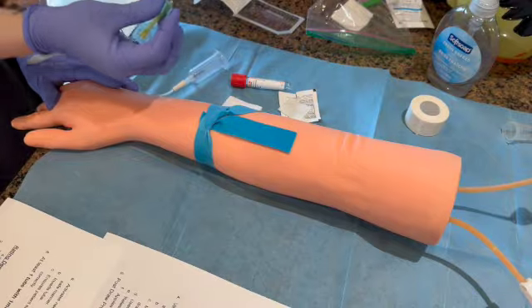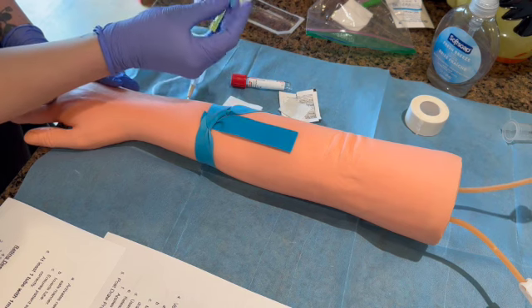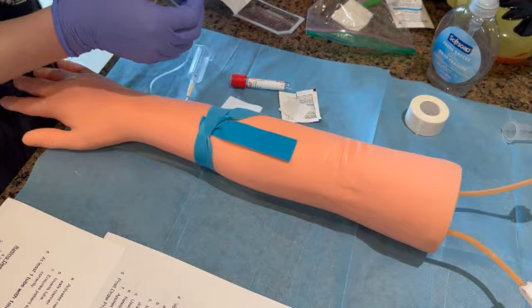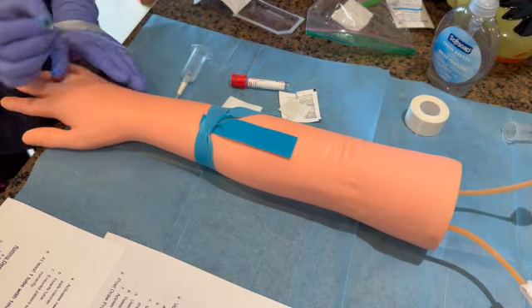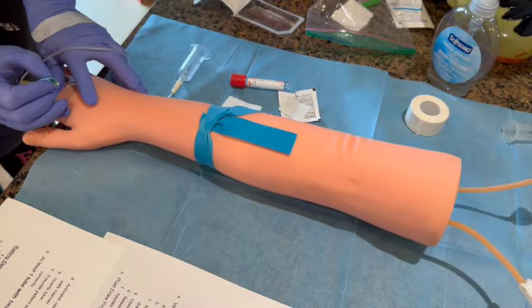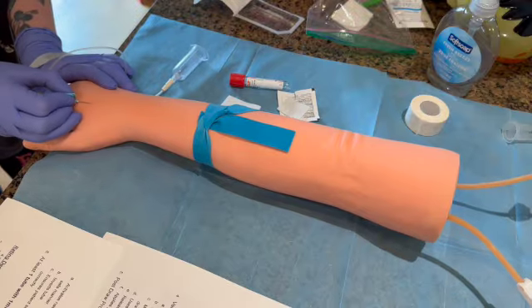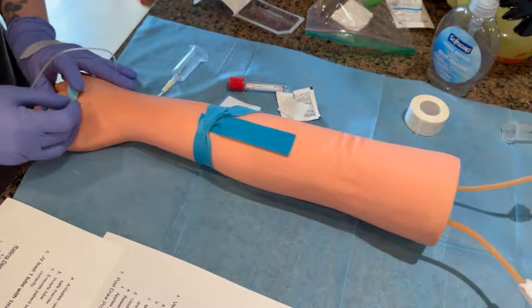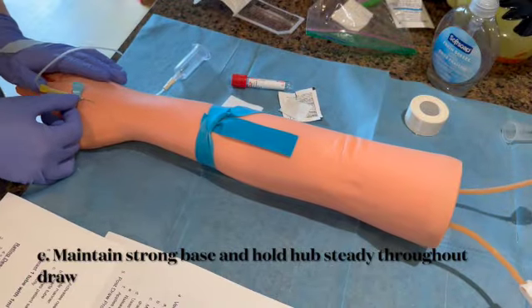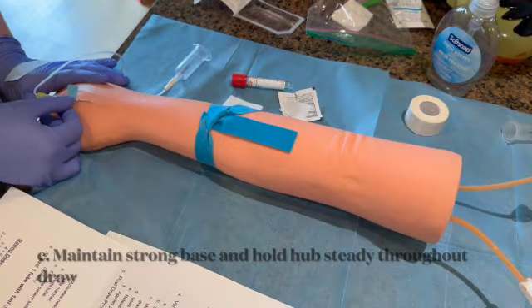And remember also, you guys, you wanna make sure that you can see your window. So whether holding it this way or holding this direction makes the most sense to you, totally okay by me. Just make sure that you're in good control of that needle the entire time through. So we're gonna go nice low angle, 3, 2, 1. And no flash yet, which is okay. We're gonna autocorrect by pulling back a bit.